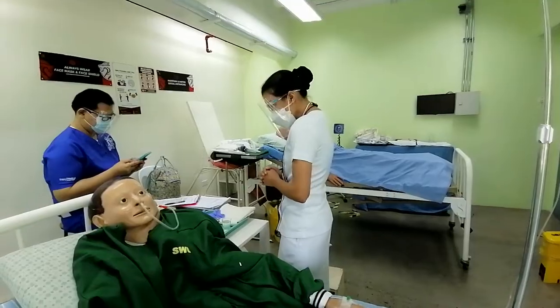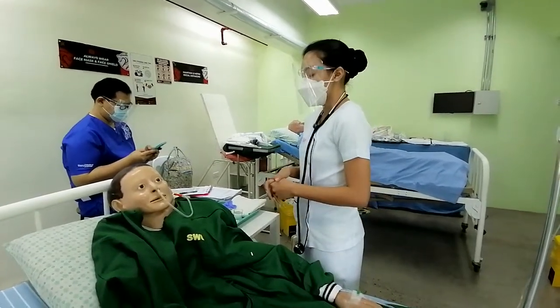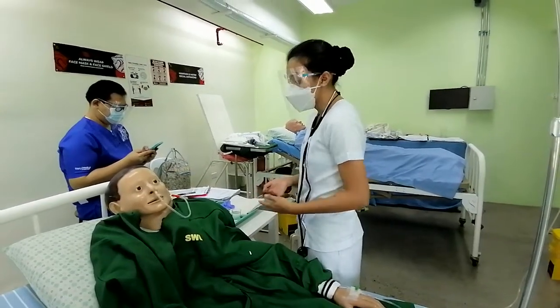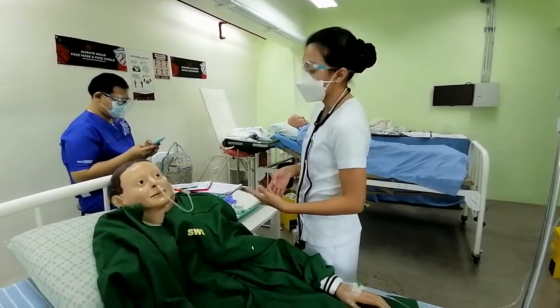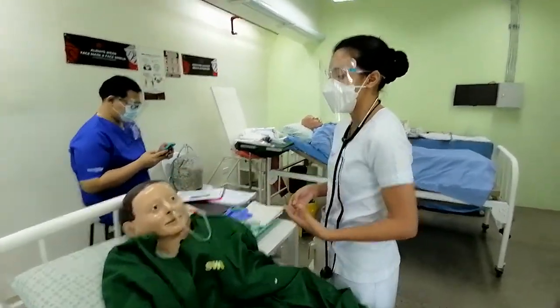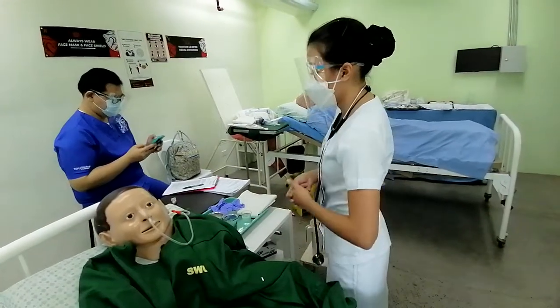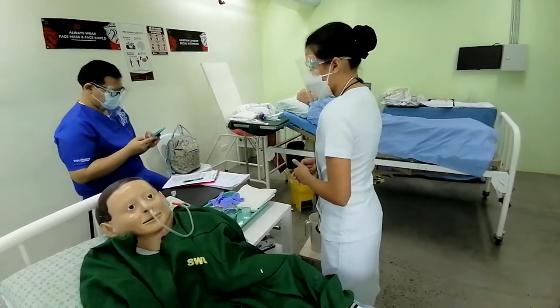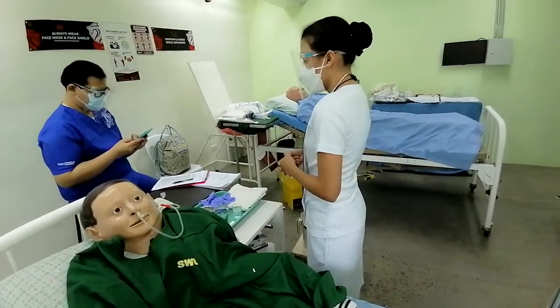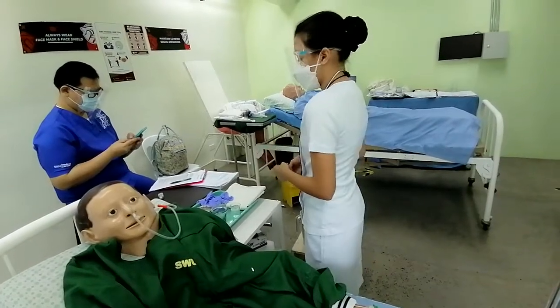And then I will now position the patient in a high Fowler's position. The purpose of this is that it will prevent the patient from aspiration, and also due to gravity, it will also facilitate the flow of the food down to the stomach. And then I will perform hand hygiene and gloving. The purpose of hand hygiene is that it will eliminate microorganisms, and gloving will also protect us from the oral secretions from the patient.